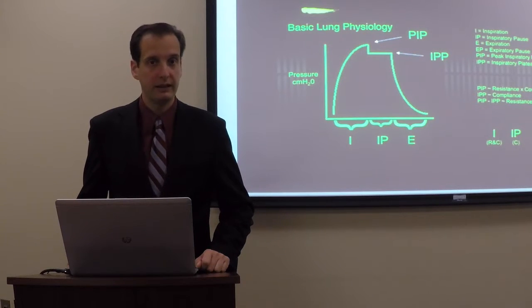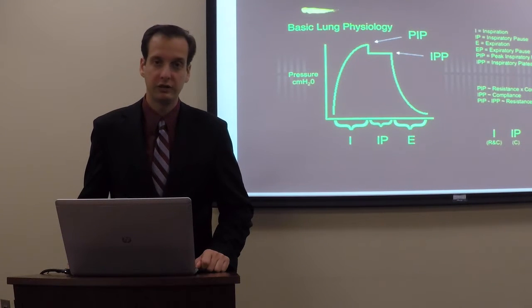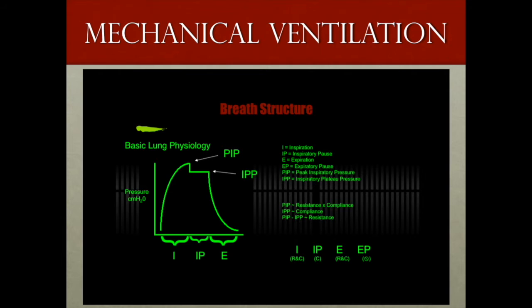Before we start our in-depth discussion on mechanical ventilation, it is first important to establish a common language, and we will do this through the exploration of basic pulmonary physiology and the establishment of a common language that we will be using throughout the rest of the lecture. On this slide, you see a complete breath pattern. On the x-axis, you can see different phases of respiration. We have inspiration, an inspiratory pause, and expiration. And on the y-axis is pressure in centimeters of water.